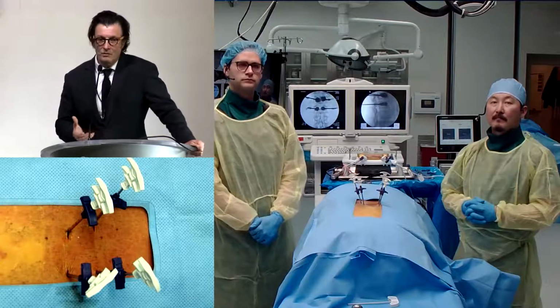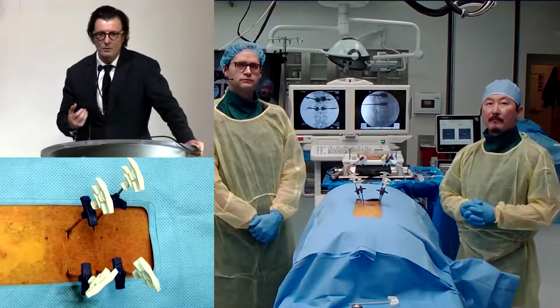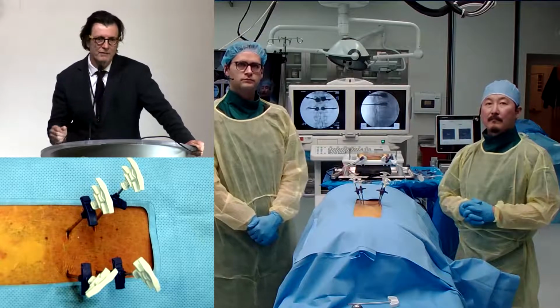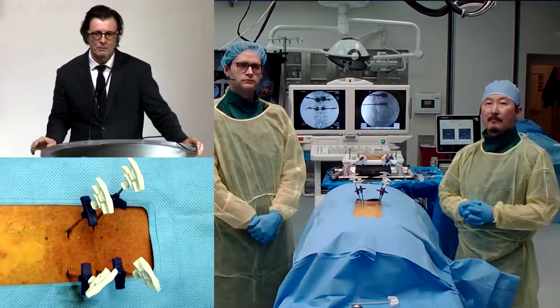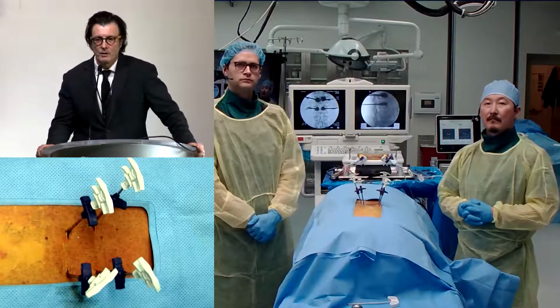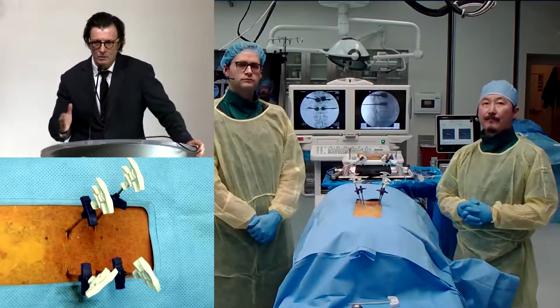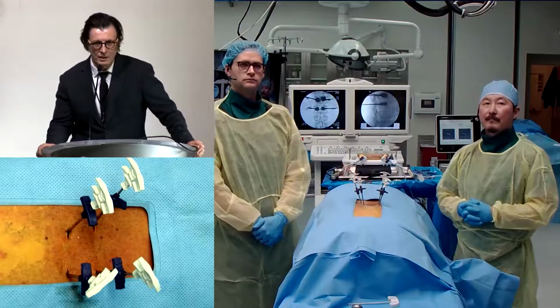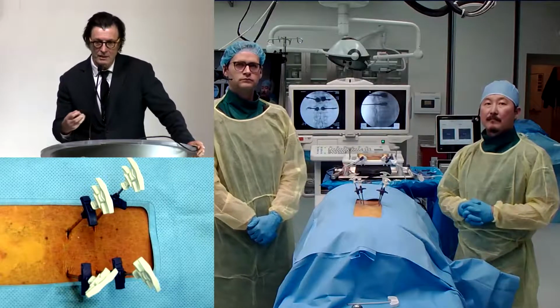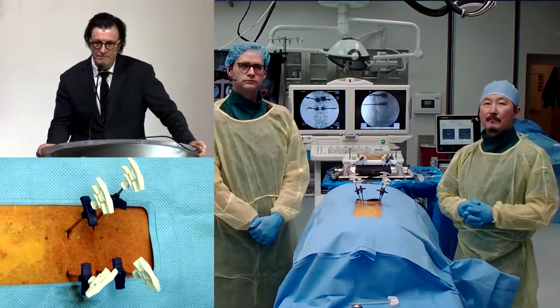So now you're doing a laminectomy with cement in the canal, you may take the facet, and you may have to do instrumentation after that. My point is that this is part of the risk of the procedure. You want to mention that there's always a chance of cement migration into the canal that may necessitate emergent surgery to take the cement out or decompress the spinal canal. It has to be part of the consent.